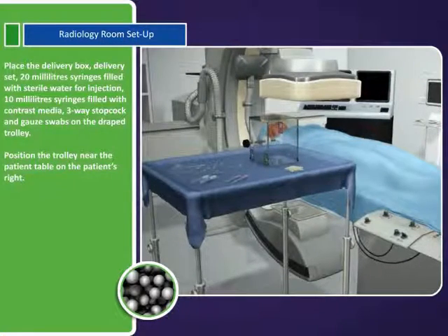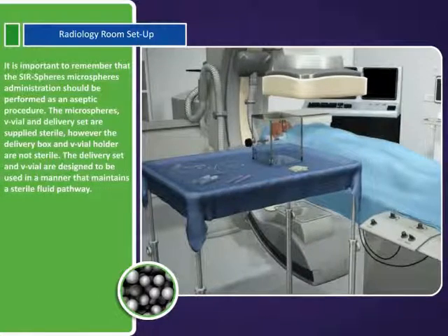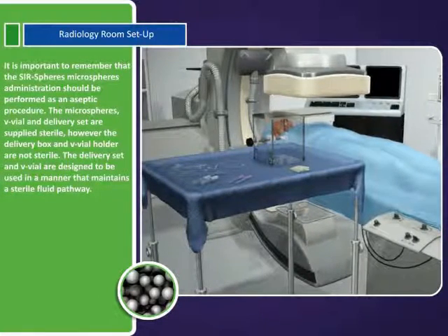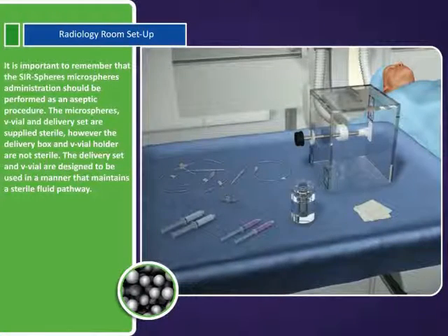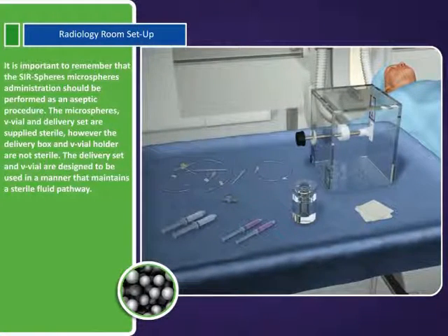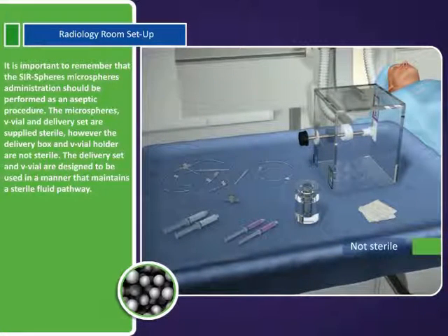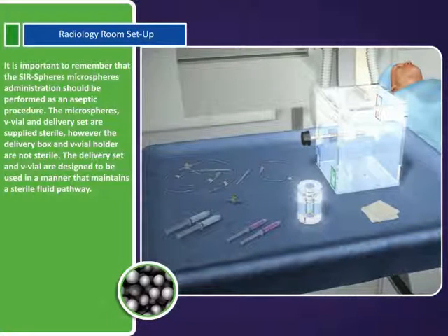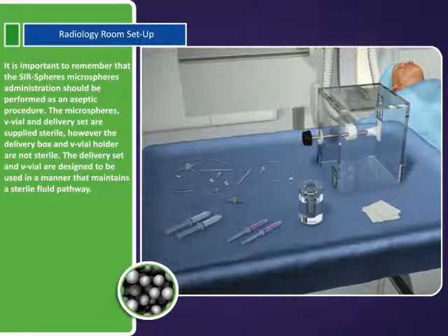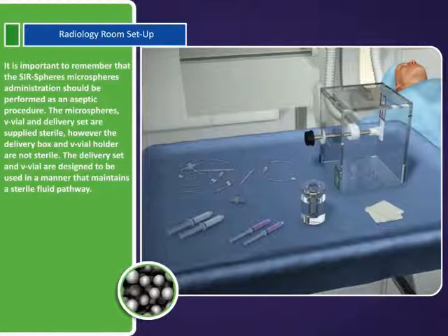Position the trolley near the patient table on the patient's right. It is important to remember that the SurSpheres microspheres administration should be performed as an aseptic procedure. The microspheres V-vial and delivery set are supplied sterile. However, the delivery box and V-vial holder are not sterile. The delivery set and V-vial are designed to be used in a manner that maintains a sterile fluid pathway.